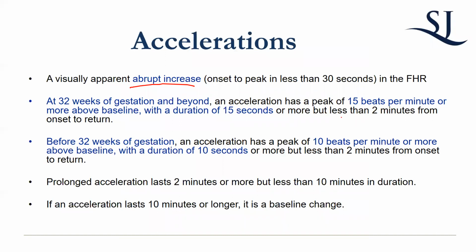And the reason for that is, to put it kind of concisely, the younger the fetus is, the less reassuring the tracing looks in terms of it fitting into the categorizations. So you won't have as well as expected variability. Sometimes you'll have little fluctuations. The reason why I mention that is that sometimes you'll be on the floor and you'll hear a resident or attending say, "Oh, well, it's pretty good for a preterm tracing." That's what they mean by that. Okay, and the criteria is slightly different. For you, it kind of doesn't really matter because it'll be pretty obvious based upon what you're looking at. But just keep that in mind.